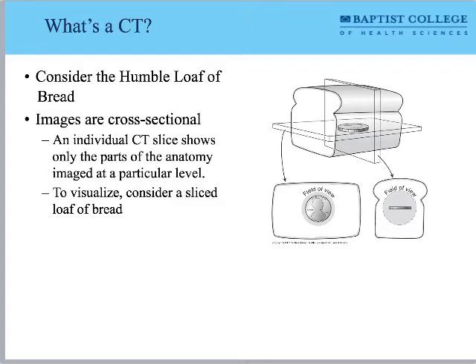We're able to see it in different orientations. Because this is built off of mathematical processes, we can look at the raisin from different directions. We can see it axially, right? So we can look at the raisin in an axial slice, like a bread slice. We can also recombine it mathematically and now slice the bread lengthwise and see that raisin from a different direction. We can slice this loaf of bread and unslice it over and over and over again.